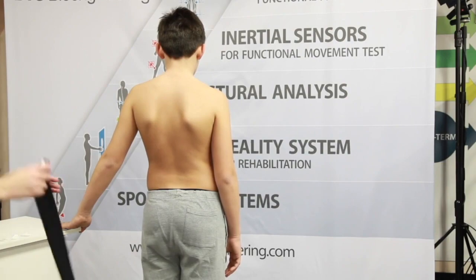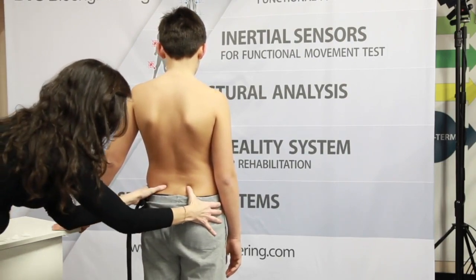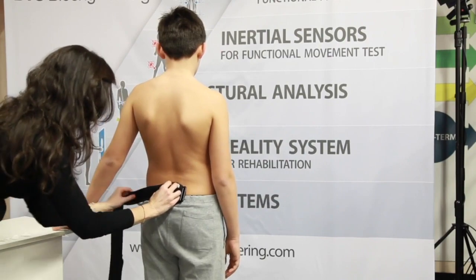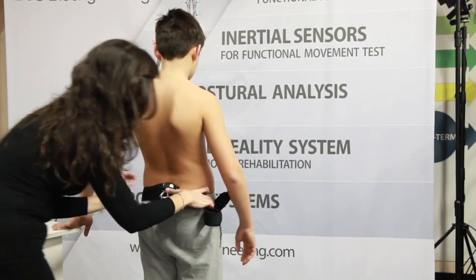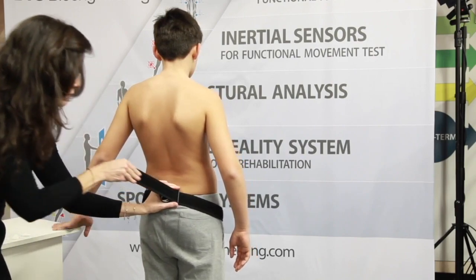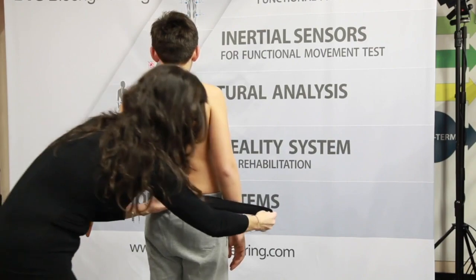Finally, we place the G sensor. We identify the two dimples of Venus in connection with the posterior iliac spines. Compared to a line that joins them, the sensor must be placed below, so as to be totally integral with the pelvis. The belt should be tight.